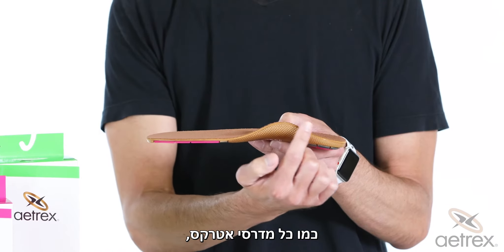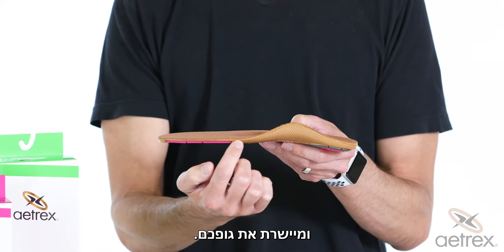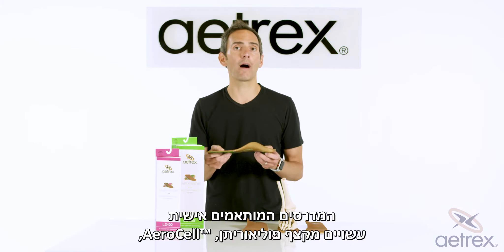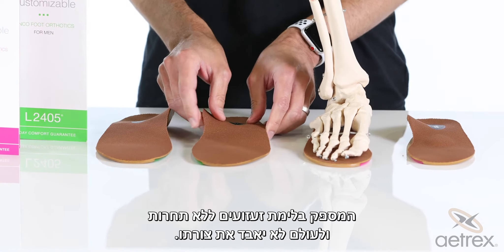Like all Aetrex orthotics, customizables come with our signature arch support, putting your body in proper alignment. Customizable orthotics are made from AeroCell polyurethane foam, which provides unmatched shock absorption and will never bottom out.